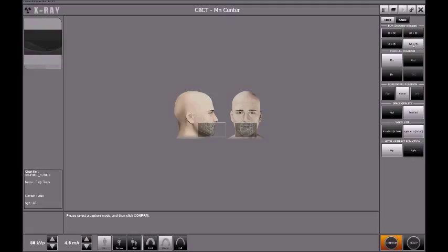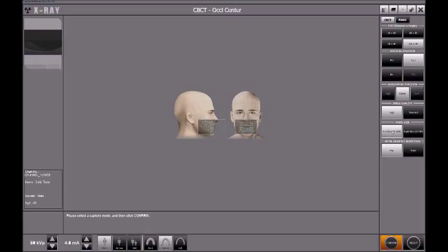All right, now once the capture software is open, just make sure to select these settings in here. Use high quality and standard voxel size, and no metal artifact reduction. For the position, just stick to occlusal, okay, for vertical position, and horizontal for a center position. After you select those settings, you can save them if you prefer.